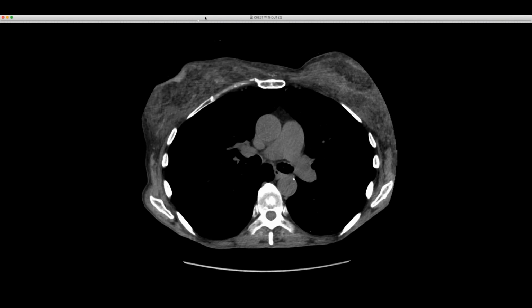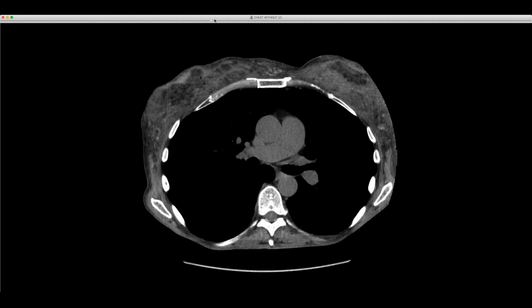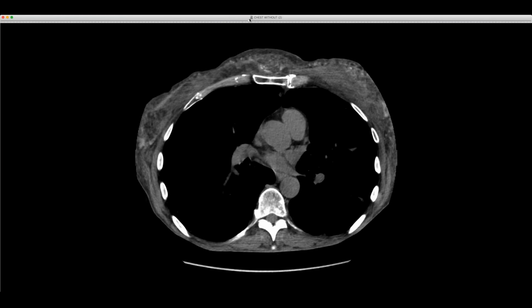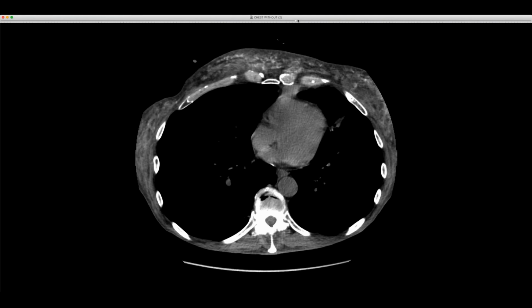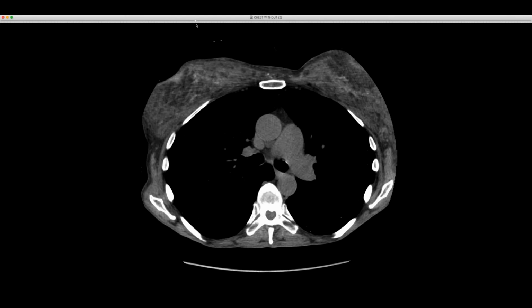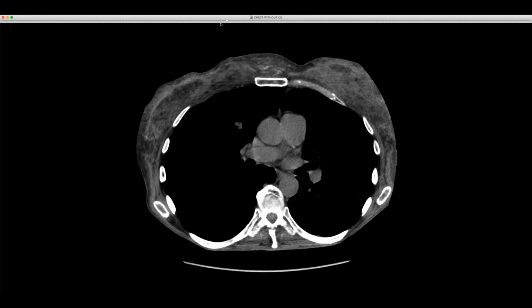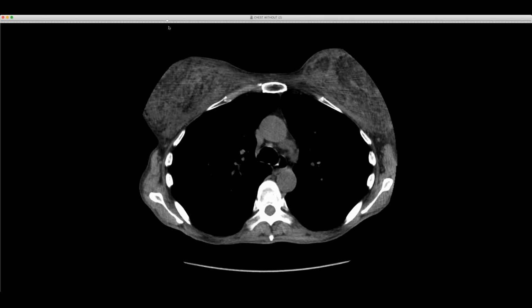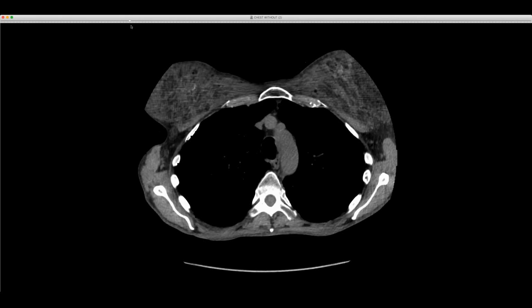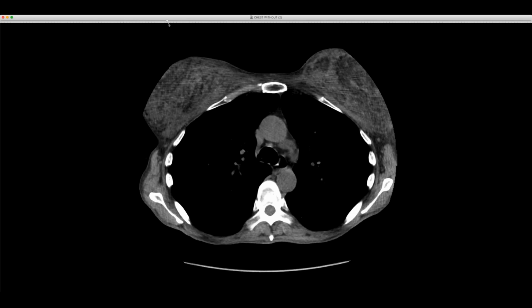This woman has a lot of silicone granulomas in the breast tissue here. Maybe had some medical tourism causing all these dramatic calcifications, stranding in the soft tissues. Then I realized this is a man, not a woman. And then I thought, well, this may be a transgender woman, or a male who was doing some body contouring with free silicone. It's actually not that either.